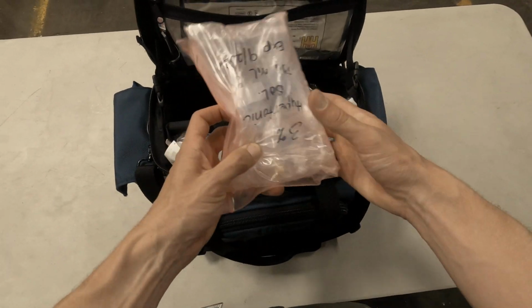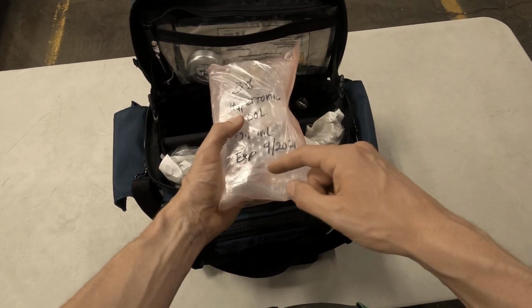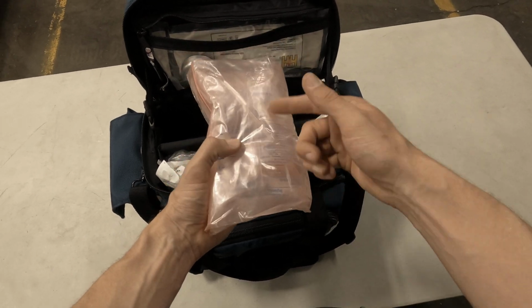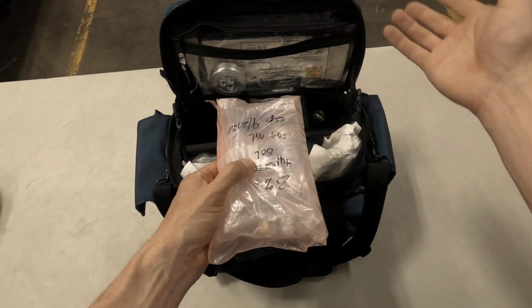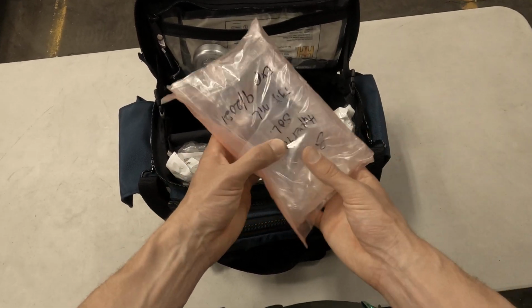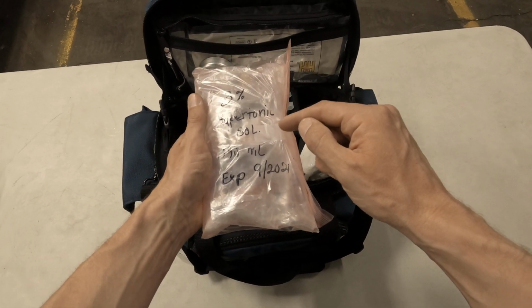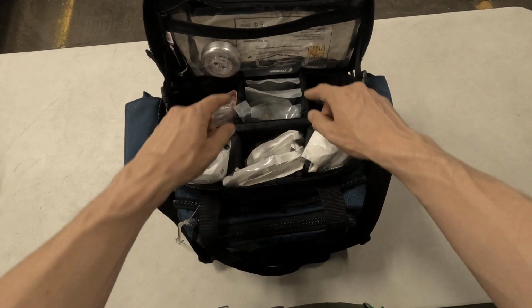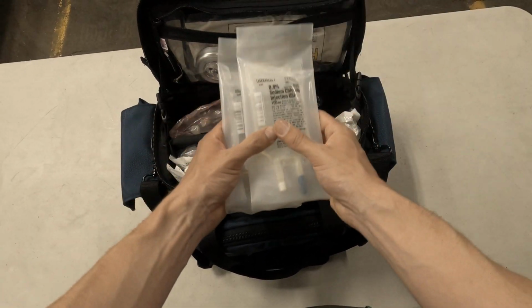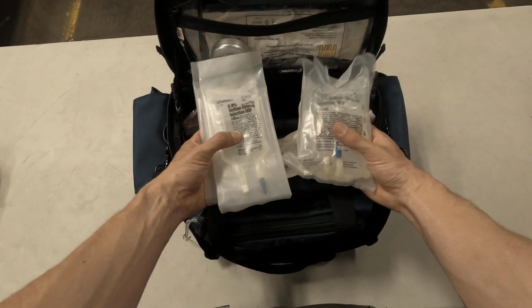Here is the hypertonic saline. It should always be covered in the pink plastic and labeled. It's also labeled hypertonic 3% saline on the bag. So as always, if you're gonna give somebody medication and something's going into somebody's body, check the label first, but you will know it's hypertonic saline most of the time since it's covered in that pink plastic wrap. Next is some spare 100 ml normal saline bags and a spare 500 ml.